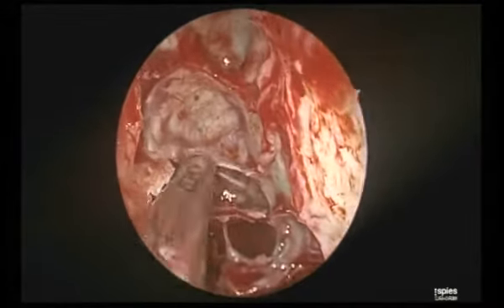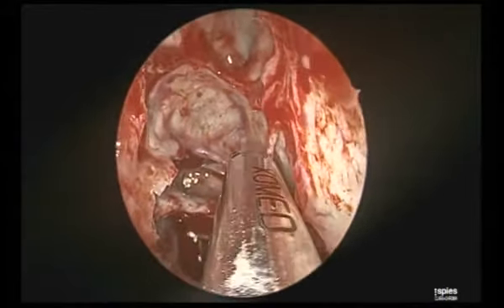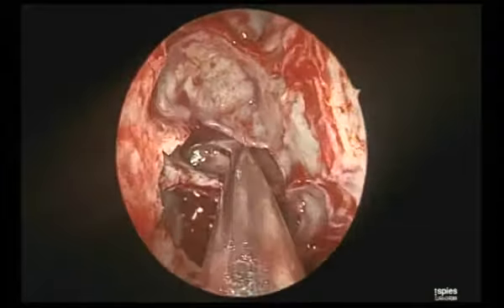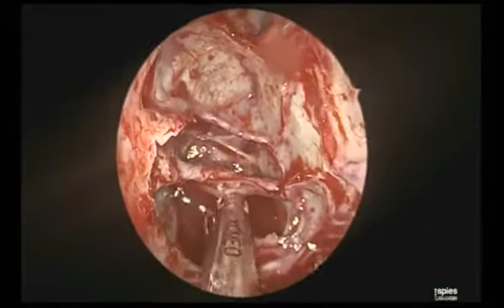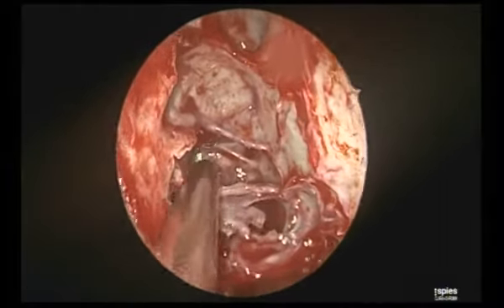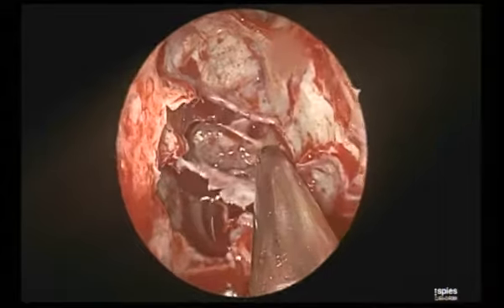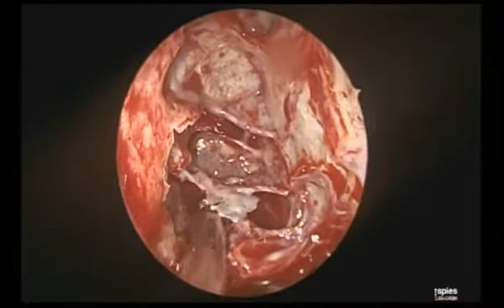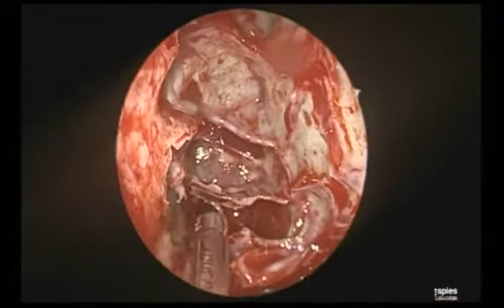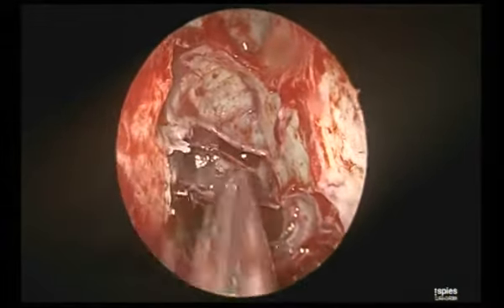Just flushing it. See, the only important thing is to preserve the mucosa like wallpaper. I don't want to remove even the smallest bit of mucosa. See the trick now, what he's doing. The debrider is also cracking that cell, so it becomes mobile and then it becomes easy for him. Unknowingly, in a microsecond, he's doing several things with the blade of his debrider.